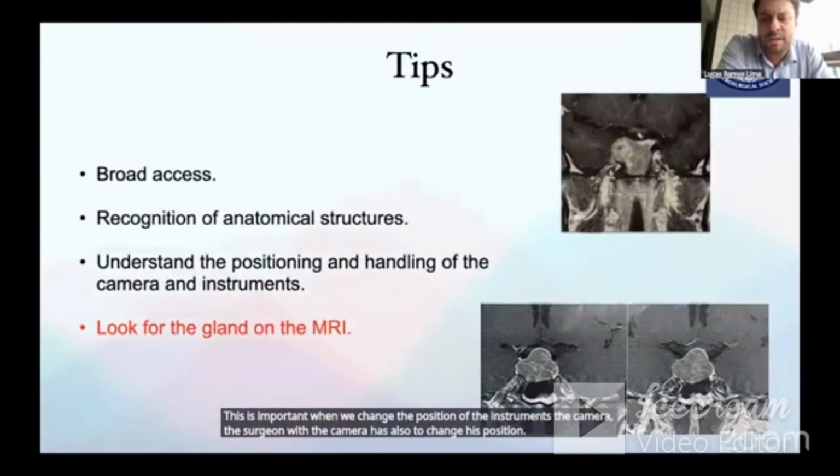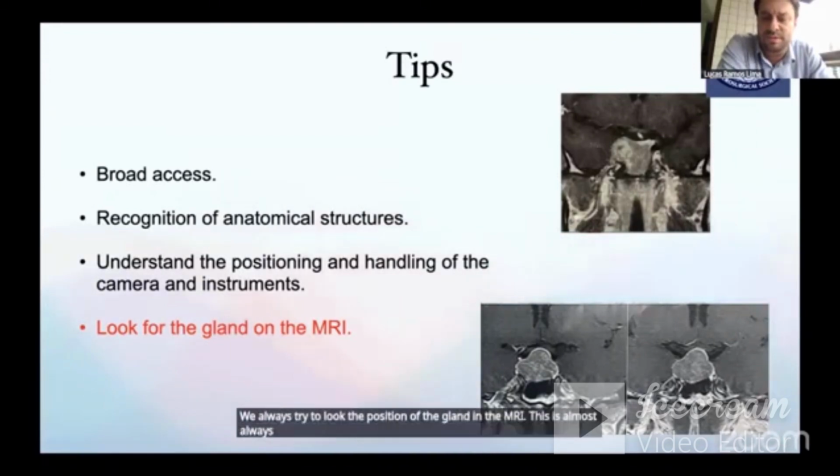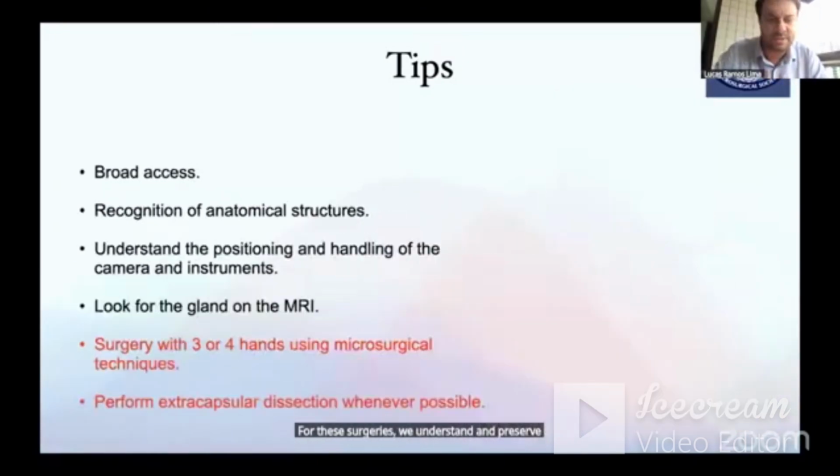We always try to look for the position of the gland in the MRI. This is almost always possible to understand. So this is one of the things that improved with endoscopy for these surgeries. We understand and preserve the gland during surgery.